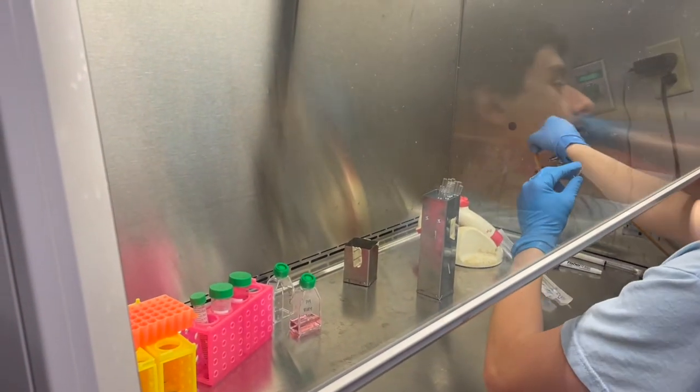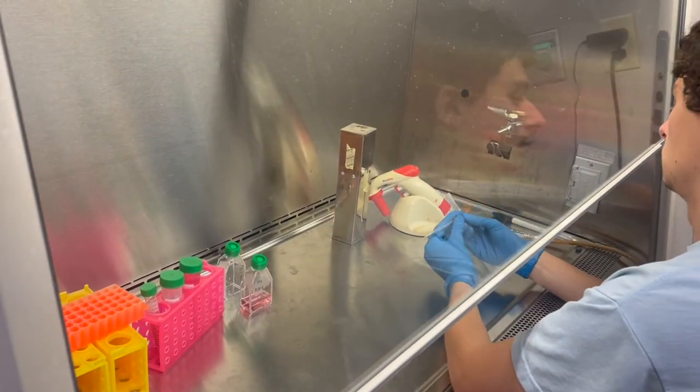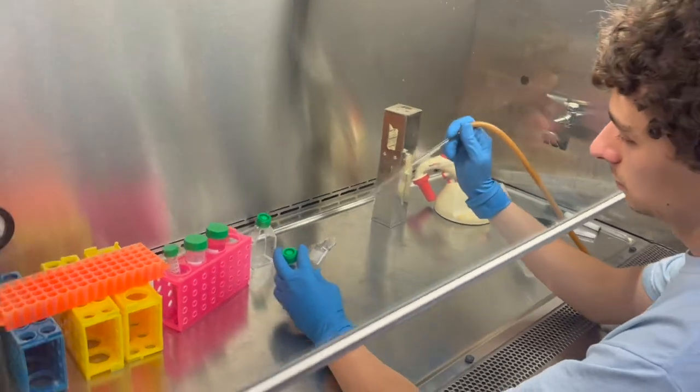Take out a vacuum pipette and place it on the vacuum tube, only touching the top part of the pipette. Vacuum off the media from the cells by placing the vacuum tube in the front corner of the flask away from the cells.